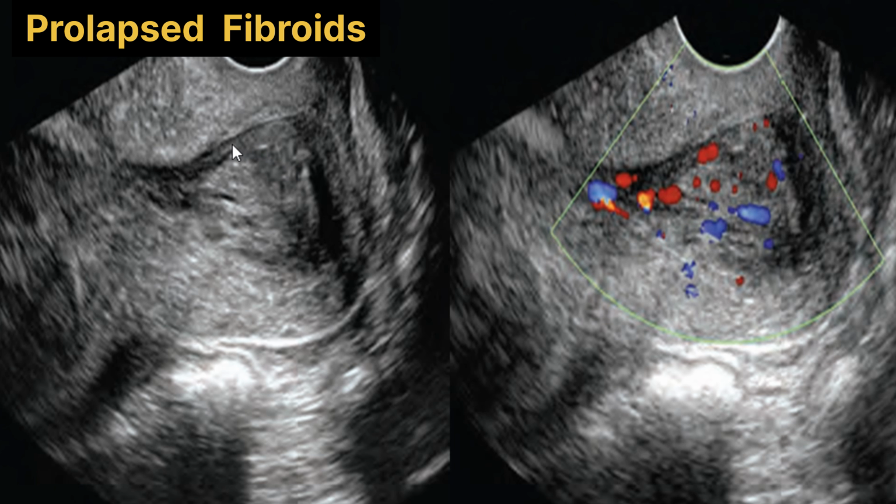Now we are going to discuss the prolapsed fibroid. This is a longitudinal image of the cervix, and this sonogram reveals a hypoechoic mass that is distending the endocervical canal, containing a fibroid that prolapsed from an intracavitary location in the uterine body into the cervix of the uterus. And this is the longitudinal transvaginal image of the cervix with color Doppler corresponding to this image, and it demonstrates blood flow in the fibroid. So this color Doppler proves that this is a prolapsed fibroid.